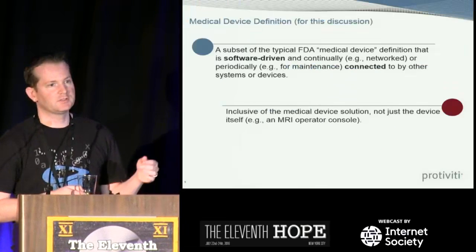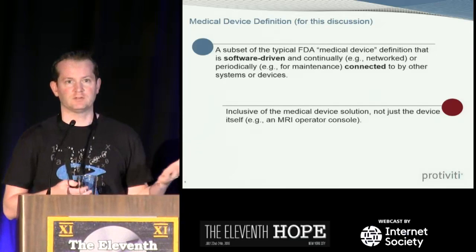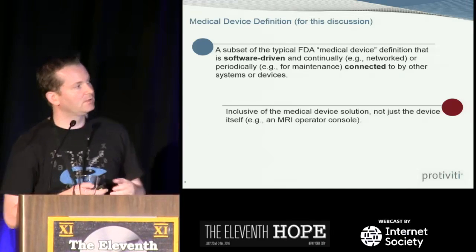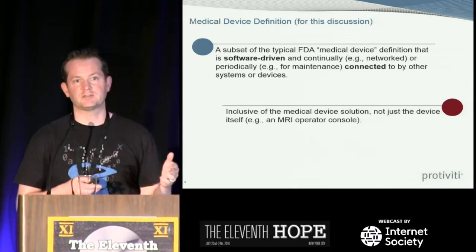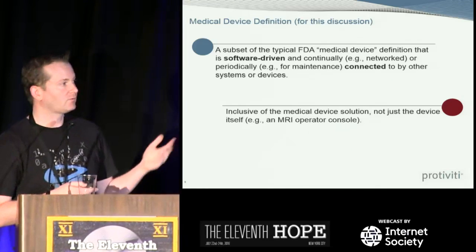Before we get into this too much, just by way of definition, when we talk about medical devices, that can mean different things to different people. It could mean a surgical instrument, for example. We're talking about software-driven and continually or periodically connected devices. So these are devices that will at some point connect to a network and also have software in them.